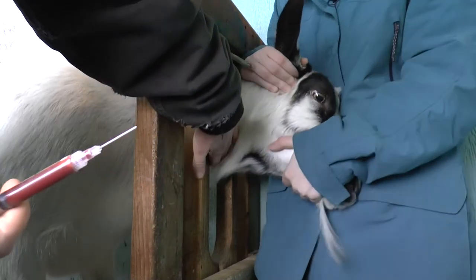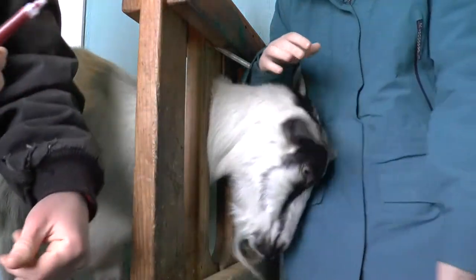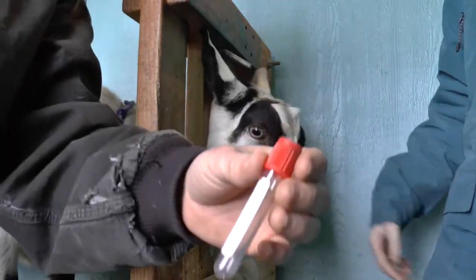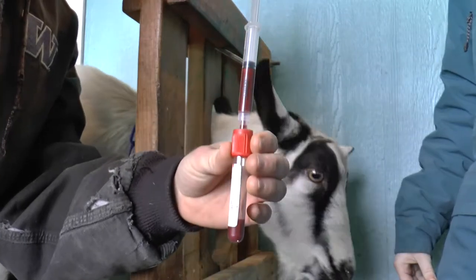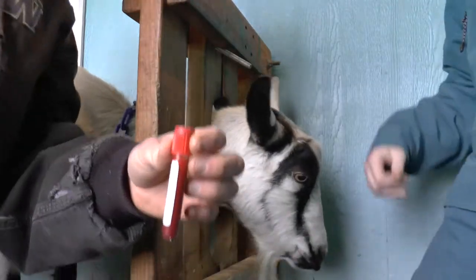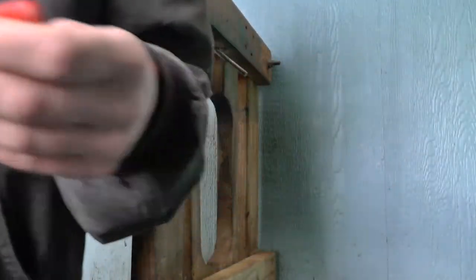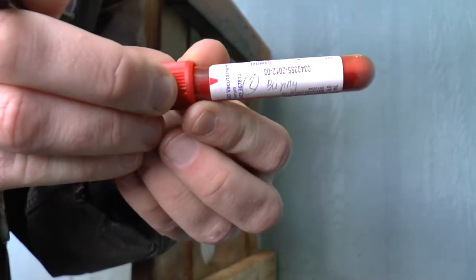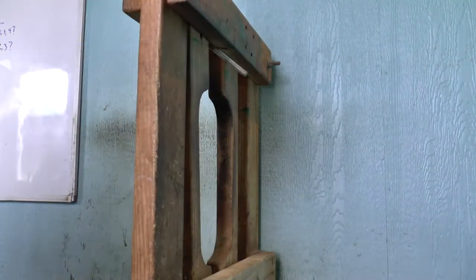There we go — easy as that. I'm going to put a little pressure on it for a bit so it does not bleed too much. I'll give them a cracker to make them feel happy. Then you just put the blood right into the tube here. If these things have lost their vacuum, they're not sucking it down — you just push it in, no big deal. Make sure to mark all these as you're filling them because you're going to forget otherwise, since you can't tell them apart. I always put a number and a name and circle the number, and make sure that lines up with the paperwork I fill out.